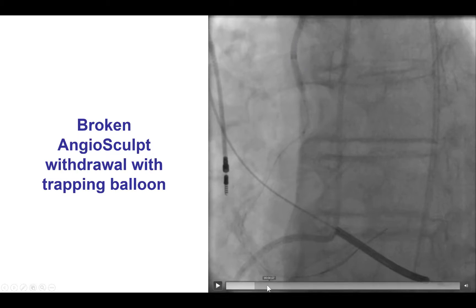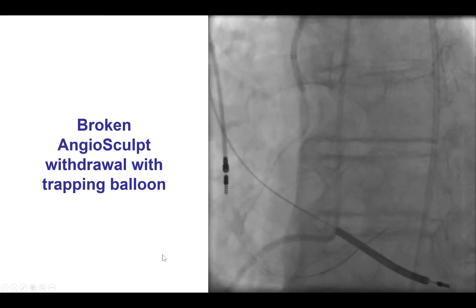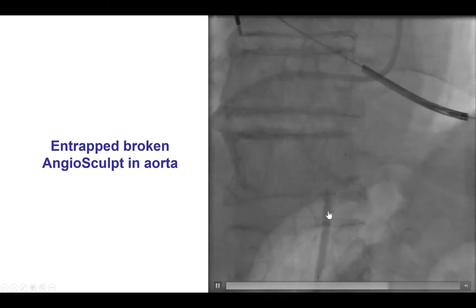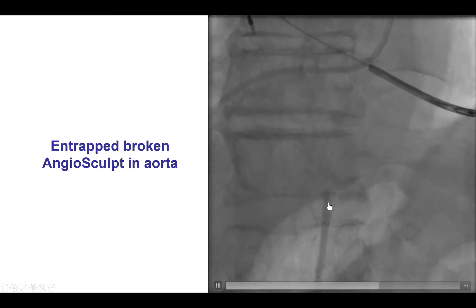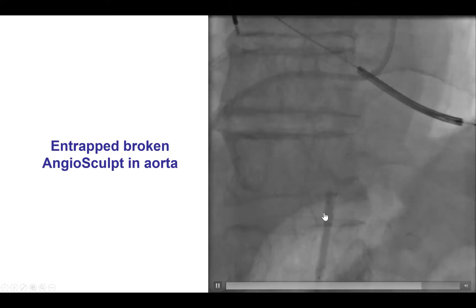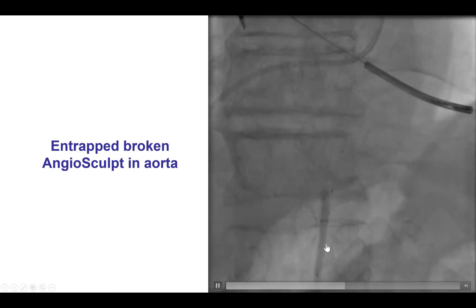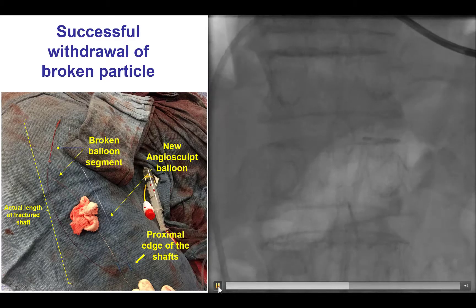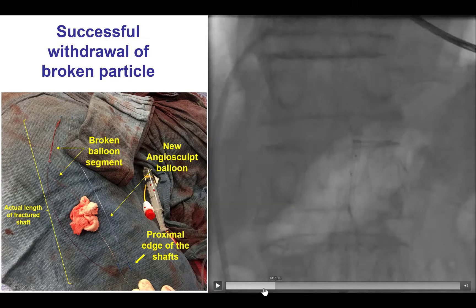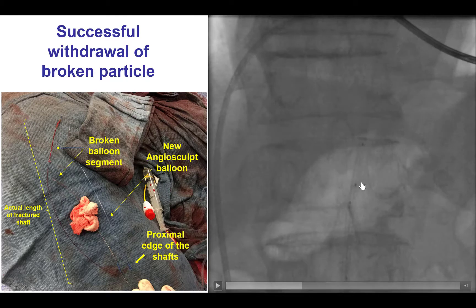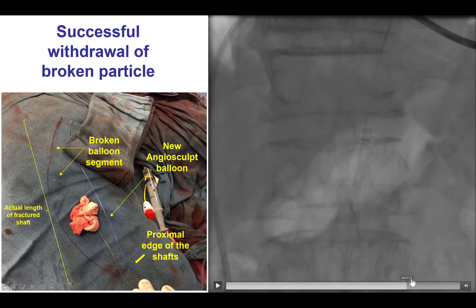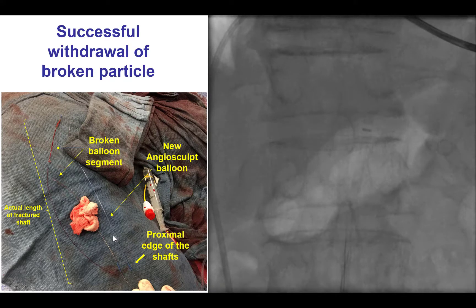As you can see, the trapping balloon was actually protruding partially from the guide catheter, but we did have a significant portion of the balloon inside the guide catheter. Unfortunately, when we came to the sheath, we could not pull the balloon back into the sheath because that protruding part of the balloon was too large. But fortunately, after we deflated the trapping balloon, we were then able to retrieve both the trapping balloon and the fragment of the angiosculpt balloon back into the guide and all the way out from the body.